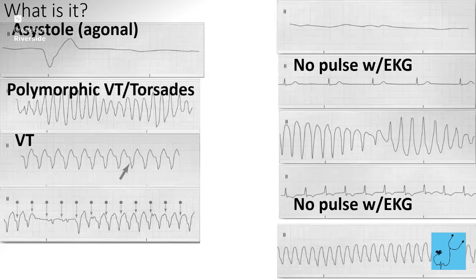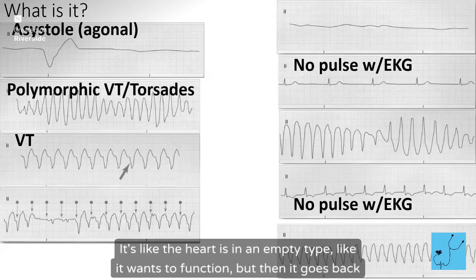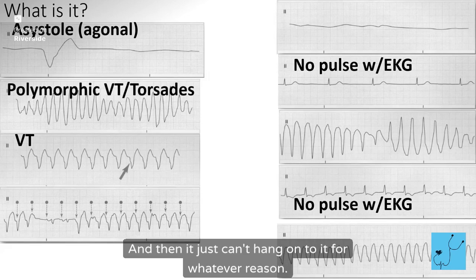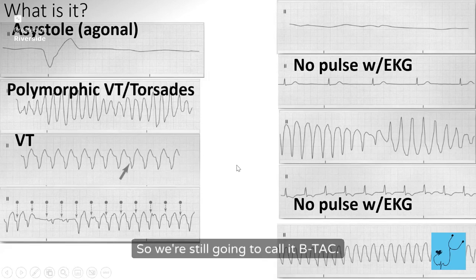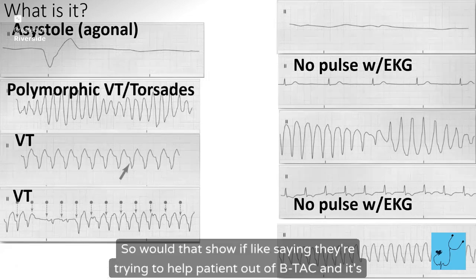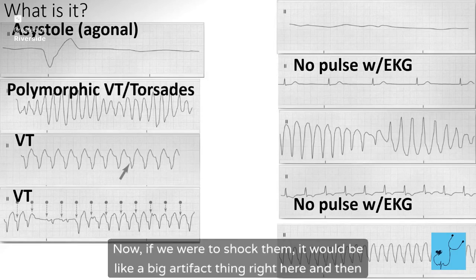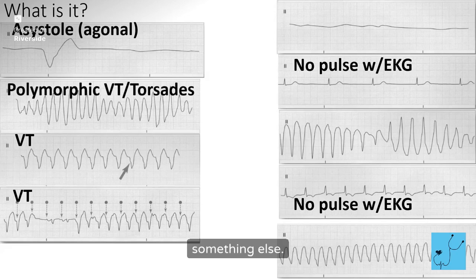What are these? It's like the heart is in and out of the tach, like it wants to function, but then it goes back to its rhythm. And so this is probably a P wave, right? And then kind of a wide QRS. And then it just can't hang on to it for whatever reason. So we're still going to call it VTAC. So would that show if they're trying to help the patient out of VTAC and it starts to function, but then it just goes back out of it again? It can. Now, if we were to shock them, it would be like a big artifact right here, and then something else. So that's how you would know.